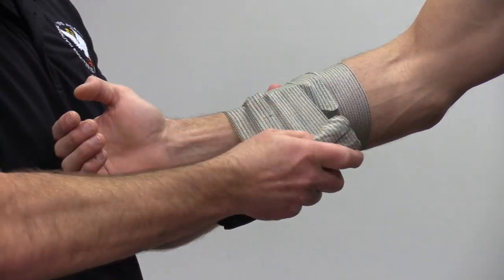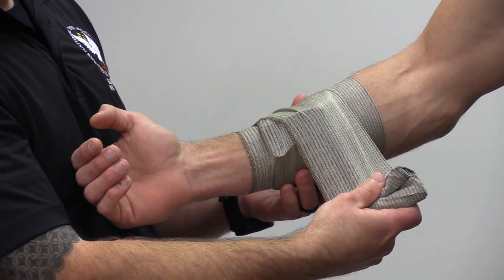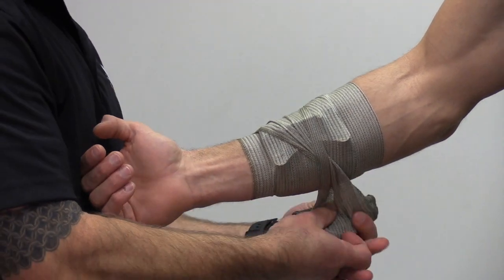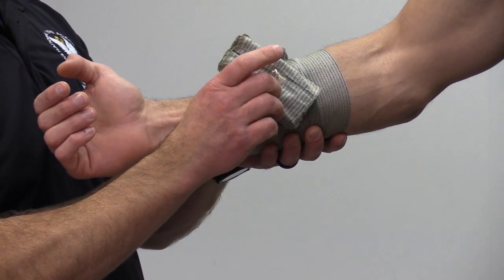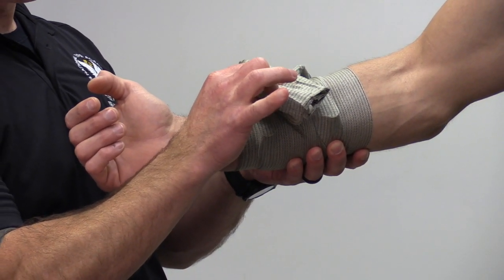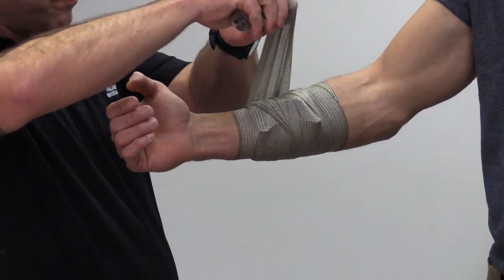Then I'm going to come a little bit low. Then I'm going to come back through the middle. Now something else you can also do, and this works also for the North American bandage, is if I put a twist in it over the injury, that helps to add a little more pinpoint pressure to it. And with the Israeli bandage, there's a string in here that helps to act similarly to the Velcro on the North American bandage to keep it from falling off on you, or unrolling.